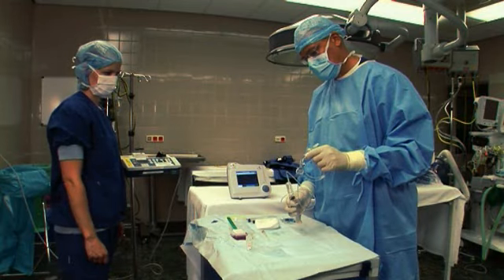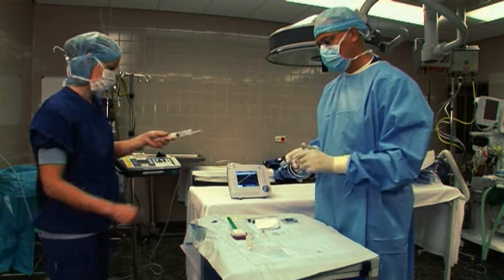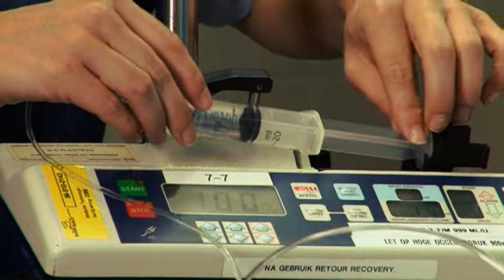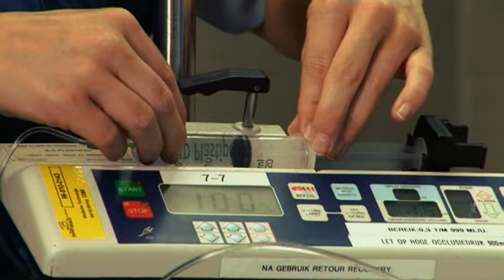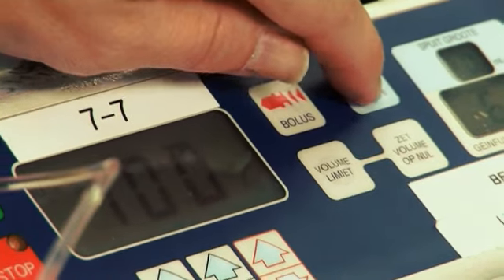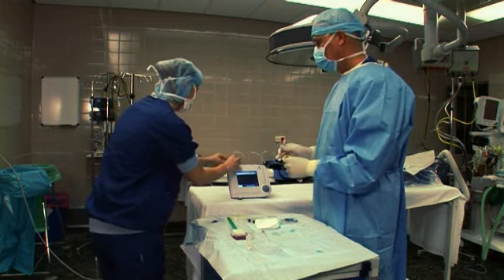Before the anaesthetist actually starts the epidural puncture, to check the system he carries out an occlusion test. This involves placing the syringe in the infusion pump with a flow of 100 milliliters per hour, and connecting the disposable to the APAD.